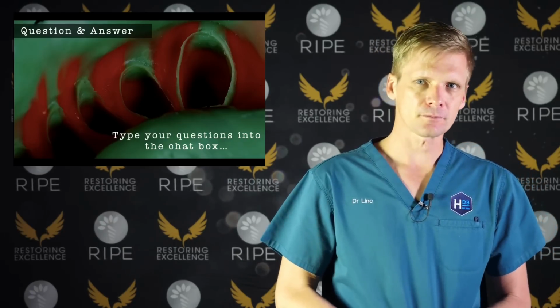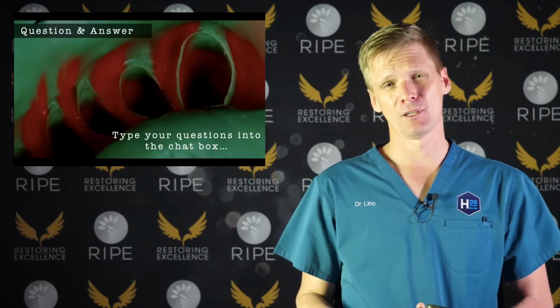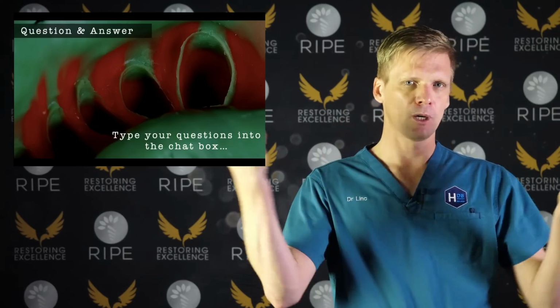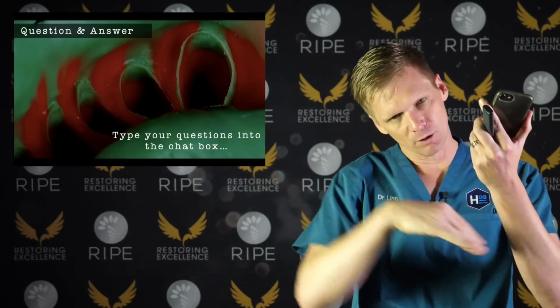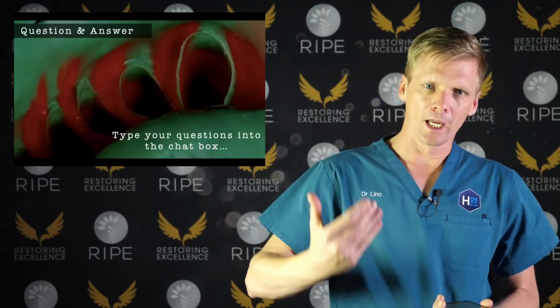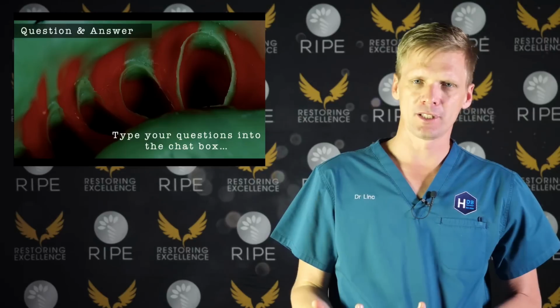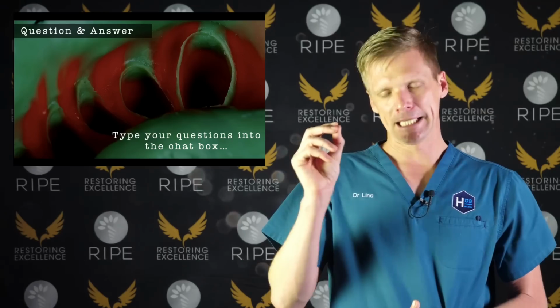The only undercuts that concern me are black triangles. If you have black triangles or where you've got a missing lower molar and the 2 adjacent teeth have fallen in like this, then the tissue will flow, the silicone will flow in underneath and you'll get it trapped in that sort of triangular area. And that's when you can have trouble getting your impressions out. But normally if you can't get your impressions out, it's because of black triangles.